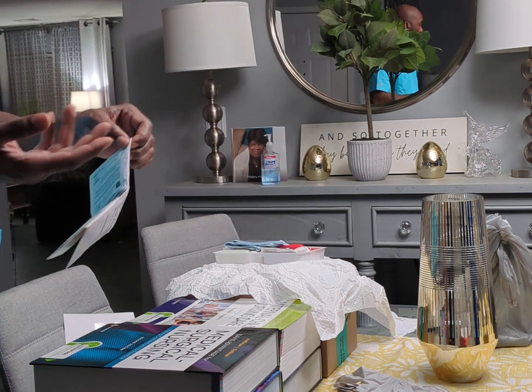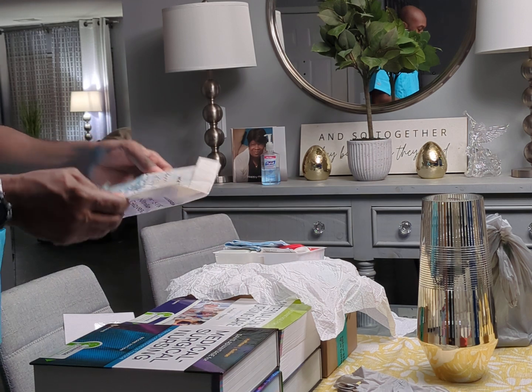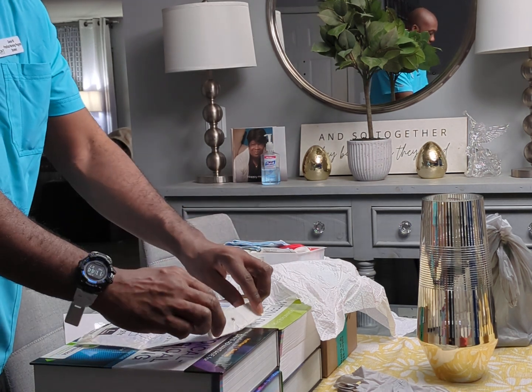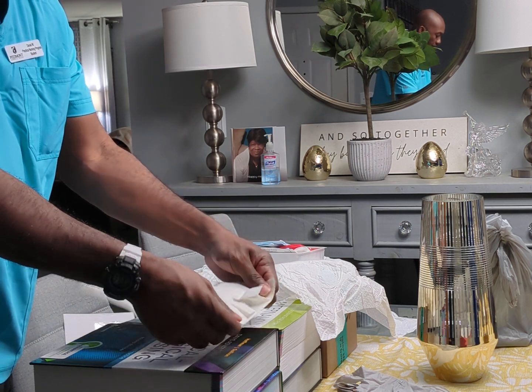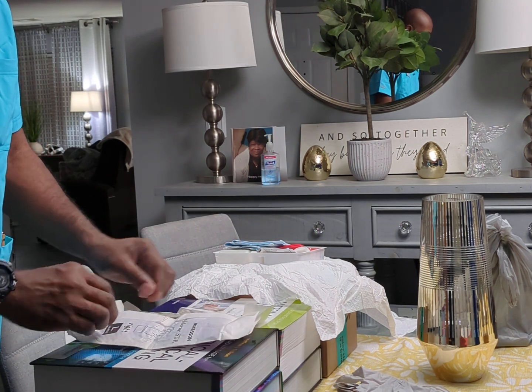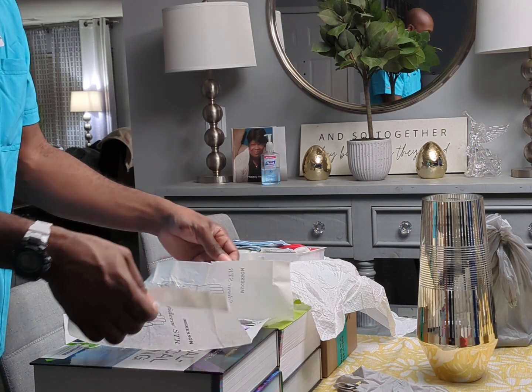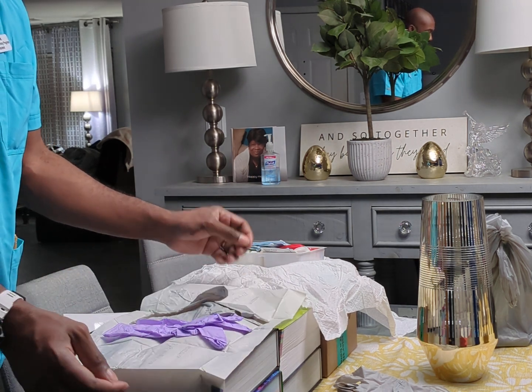Now I'm going to don my sterile gloves. Hopefully this is being caught on camera. Okay, top, the middle. All right, good deal.